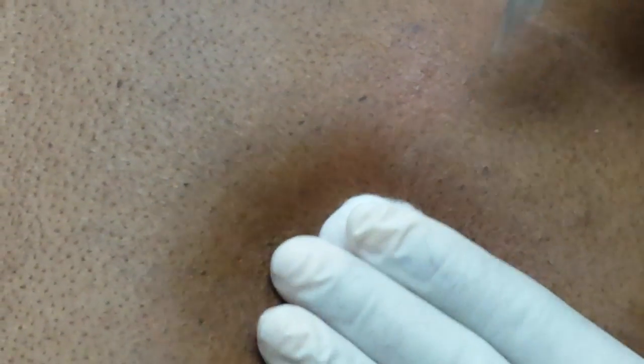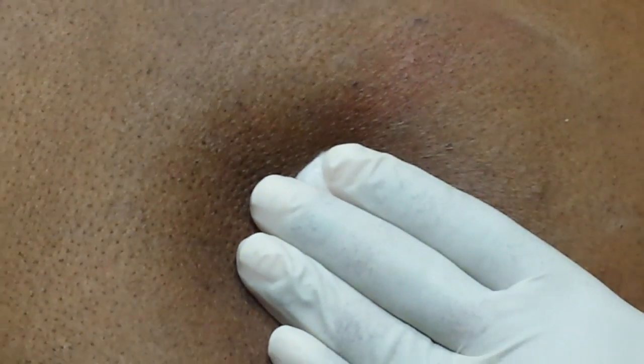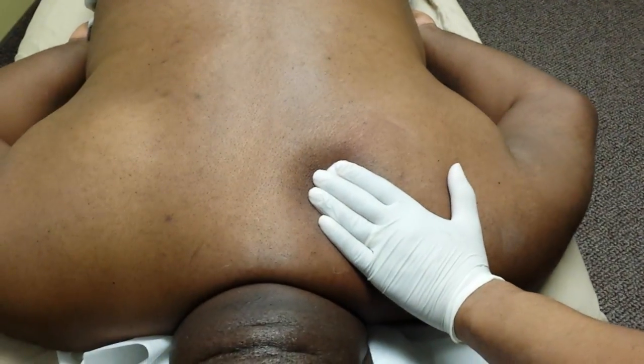And it's stuck — it won't come out. The muscle has it pulled. The muscle grab is what I mean.